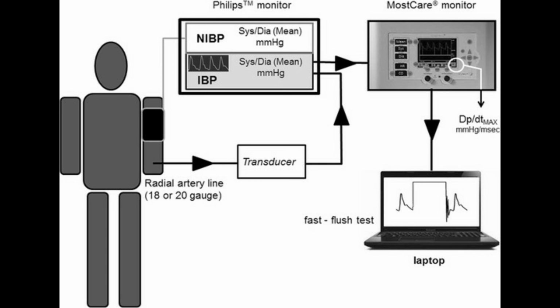The change of fluid pressure in the subject's artery is said to be measured invasively, and this is also known as direct measurement because the parameter being measured is directly coupled to the transducer.